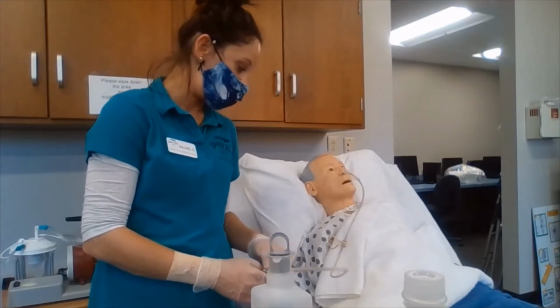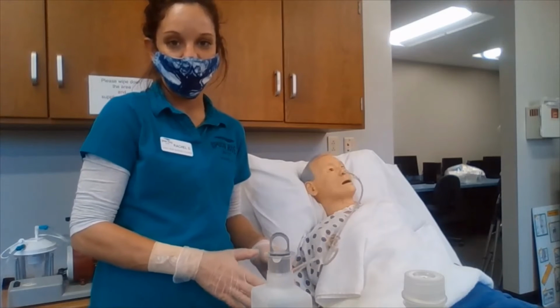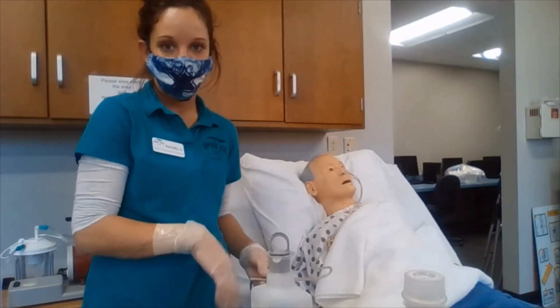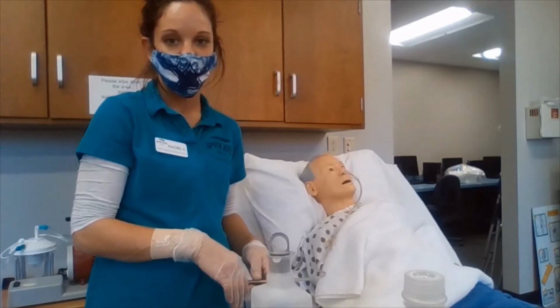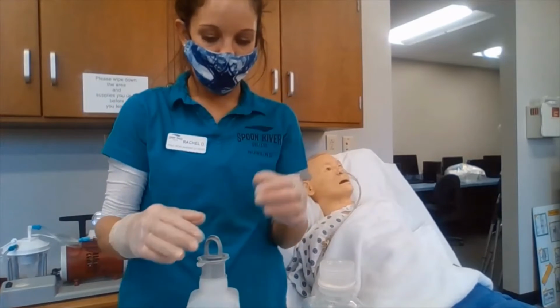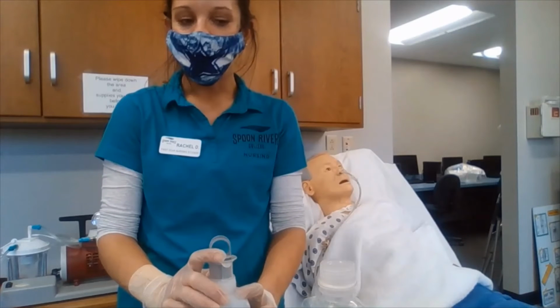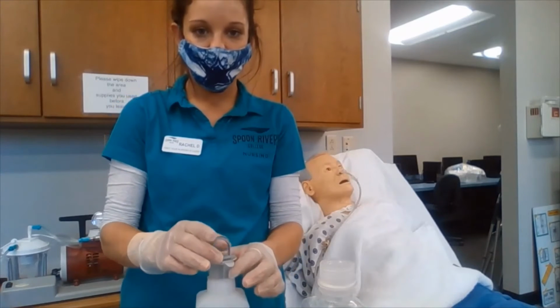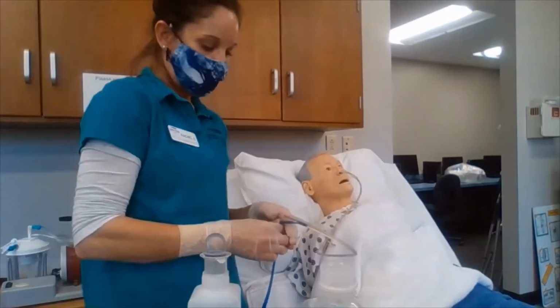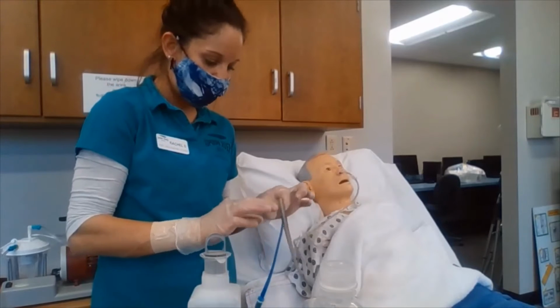for that whoosh sound. We are also going to be checking the pH balance of the gastric secretions. Again, that is between 1 to 5.5. And then we are going to be filling our syringe with 10 to 20 milliliters of either normal saline or tap water. Next thing we're going to do is either clamp or turn off the stopcock.